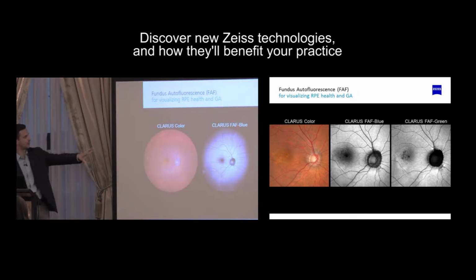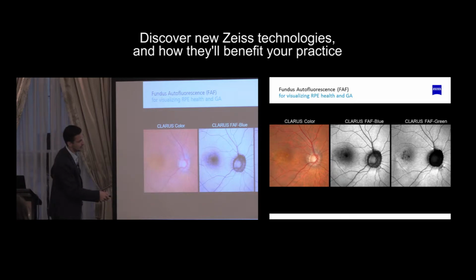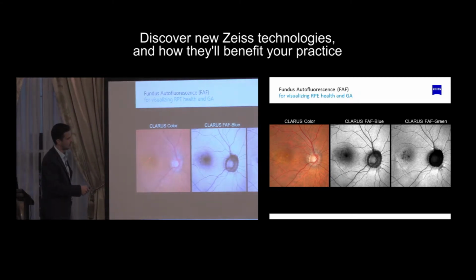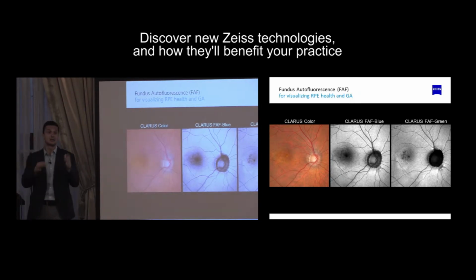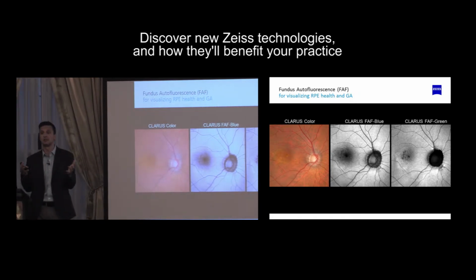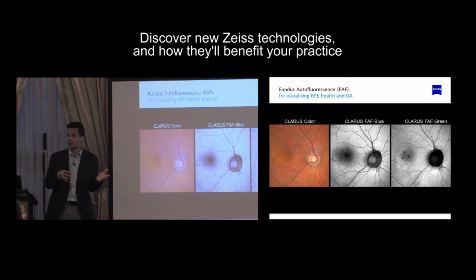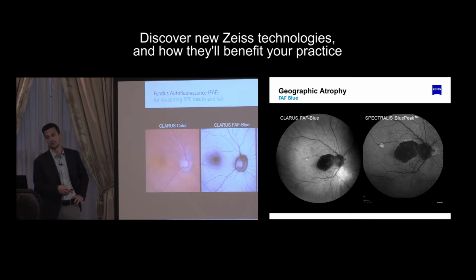And so here are 3 different images, and all 3 of those images blown up into the posterior pole. You can see the quality there, and you can see the edge of the geographic atrophy that actually shows up on FAF green, which is somewhat masked behind the FAF blue and is difficult to outline. Now, this image is so good that there are algorithms in process and being developed to actually measure FAF green and compare those over time. So it's a unique measurement tool, and again, a crosswalk. I'll reiterate that with regards to OCT technology and the possibilities there.